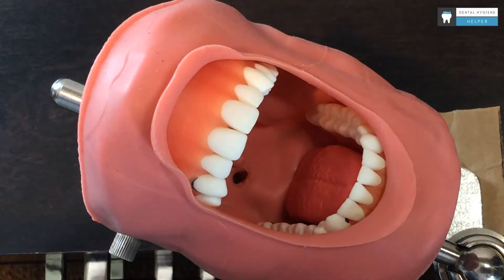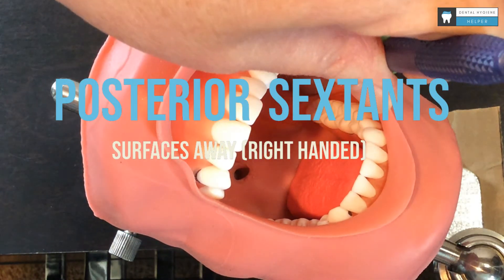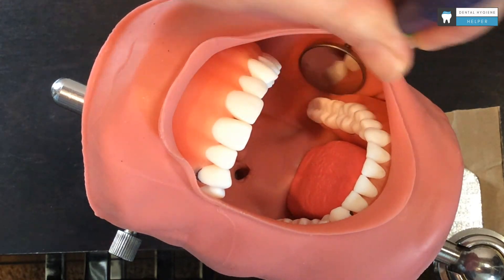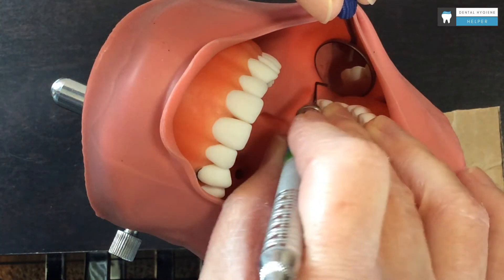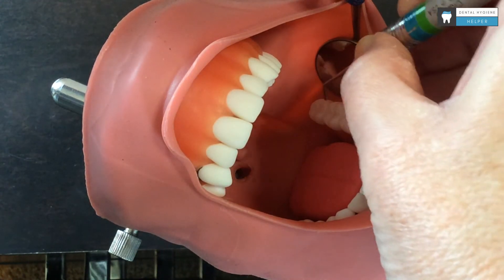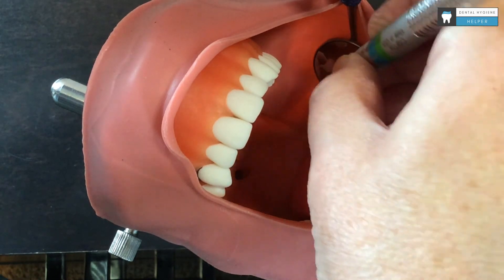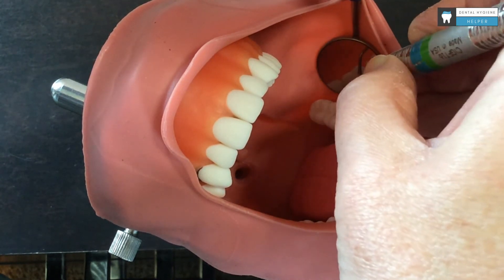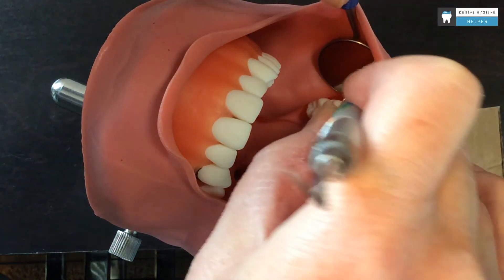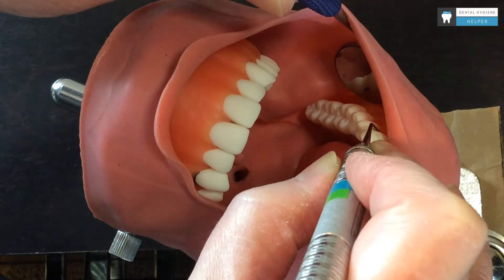And then I can come up to the 11 o'clock position, place my mirror in and retract. I am on the cusp tips of the premolars at the moment, and then coming up onto the incisals of the anteriors as I move forward.